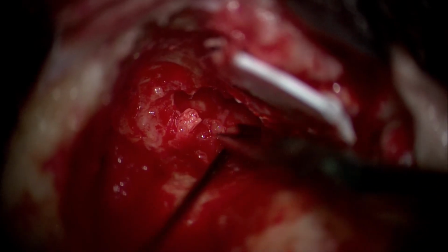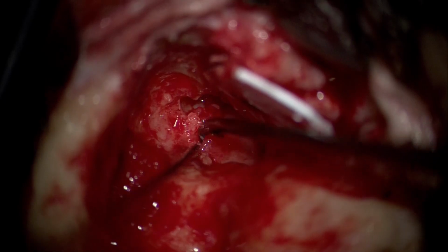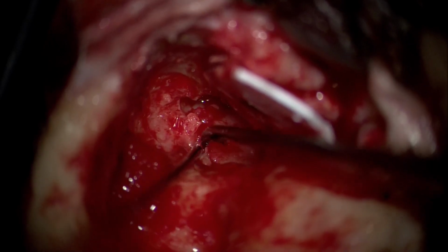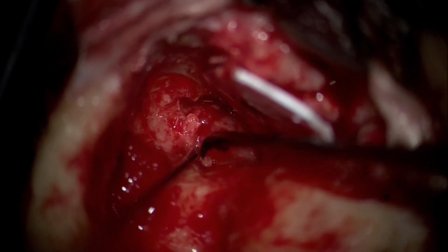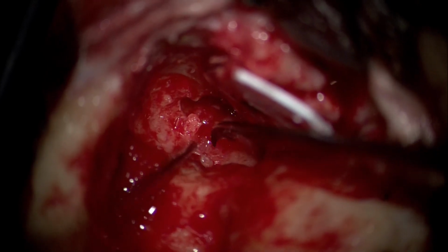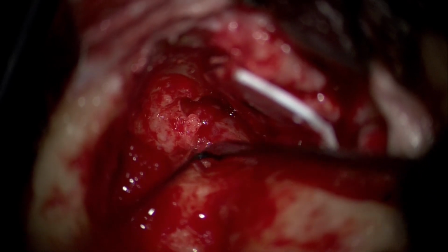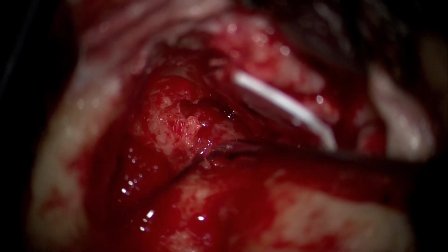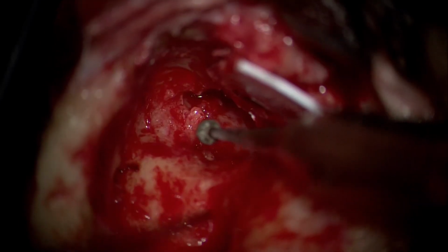And here as well, we prefer to sharply dissect structures rather than bluntly pulling, because that would devitalize the mucosa or strip the middle layer of the mucosa. So it's generally not a good idea, even though this patient has a considerable hearing loss. And once the anterior epitympanic recess and the protympanum are cleared, we get our attention and focus back on the stapes head.